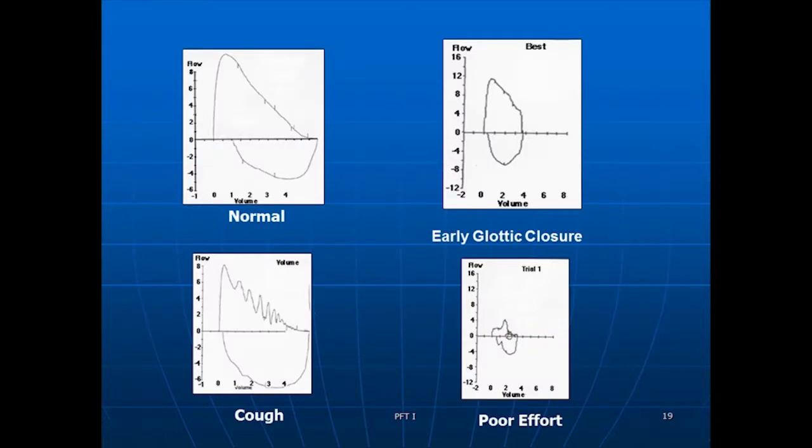So when we look at the pulmonary function tests, you're going to see a graphic picture being taken when this patient does this spirometry.